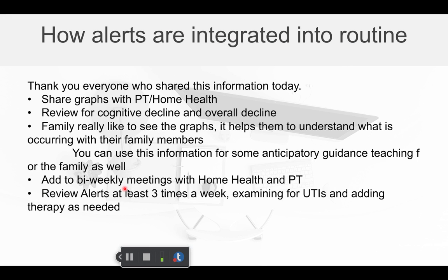Those are some of the things that we can look at to identify some patterns so that we can say, oh yeah, she had pneumonia. Then if we start to see this pattern again, we need to really pay attention to her lungs and make sure that's not recurring.